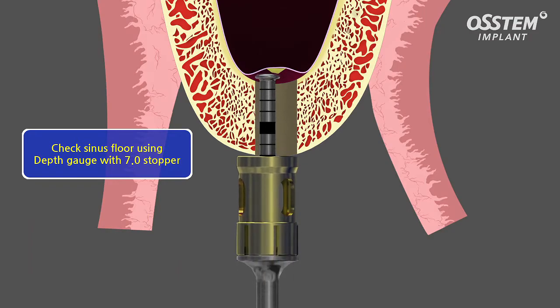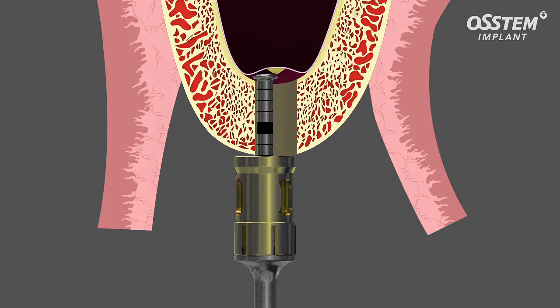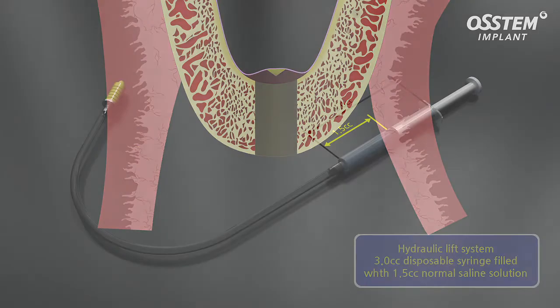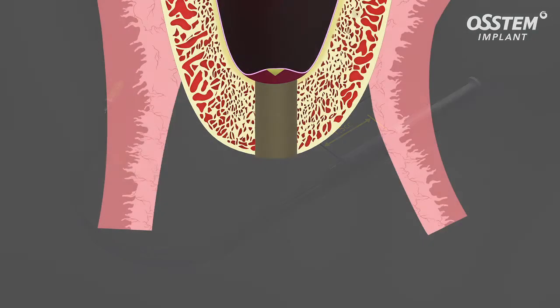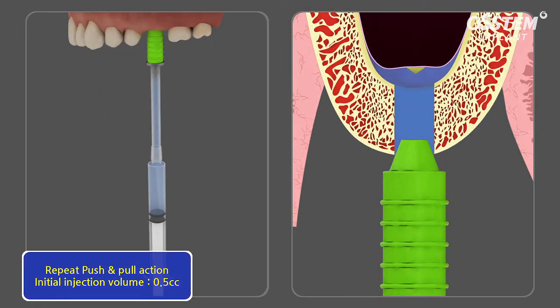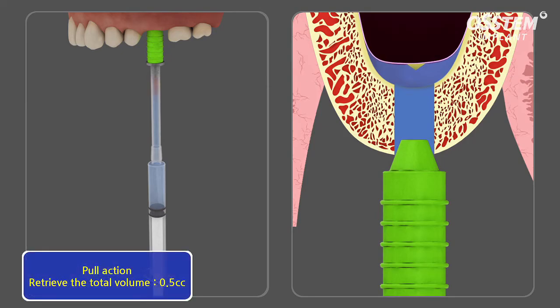By using the depth gauge with the 7 millimeter stopper, the mobility of the membrane is being tested. Saline solution is being filled into a 3 cc syringe to slowly perform the hydraulic lift of the membrane. The hydraulic lifter has to fully cover the drilling hole in order to have the needed pressure for lifting the membrane.